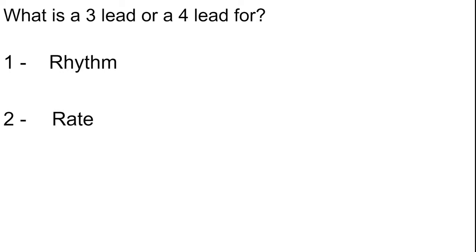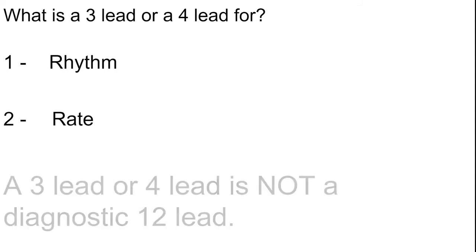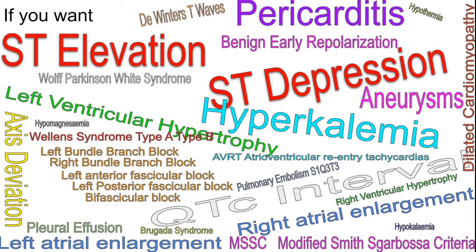If, on the other hand, you want to obtain a 12-lead and you want to know a little bit more and other information, such as, you know, quite a bit of other things. This is definitely not a comprehensive list. This is a small list of what a diagnostic 12 lead will tell you, with proper placement of the limb leads on the limbs or the deltoids and the thighs.